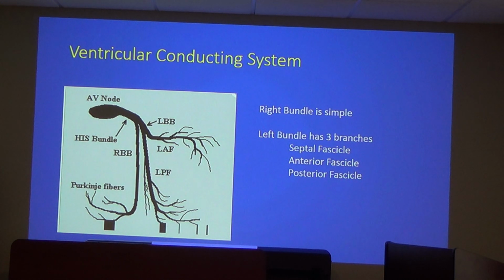So the interesting thing, and this is where I get a little bit geeky with EKGs. So the interesting thing about the left bundle branch block, where did my arrow go? Oh, there you go. Is this little thing right here. So this is what's cool about EKGs. There's actually a ton of information that a lot of smart people figured out. So this is the septal Purkinje fibers, which you'll notice come off of the left bundle, not the right bundle, for almost all people.